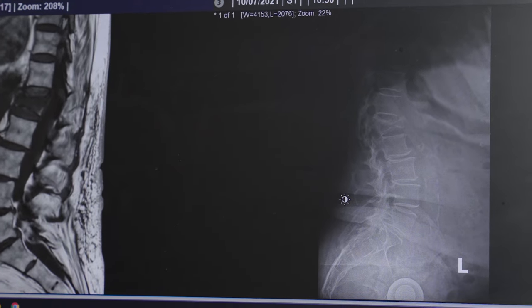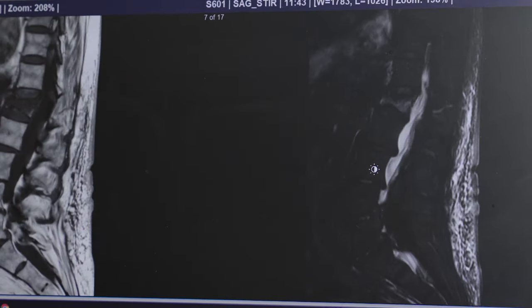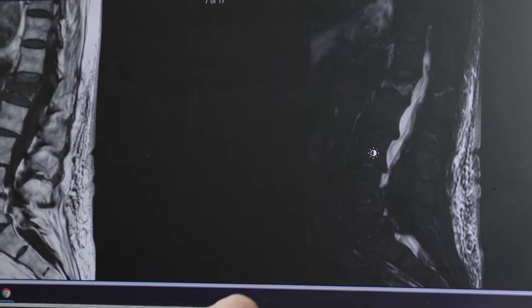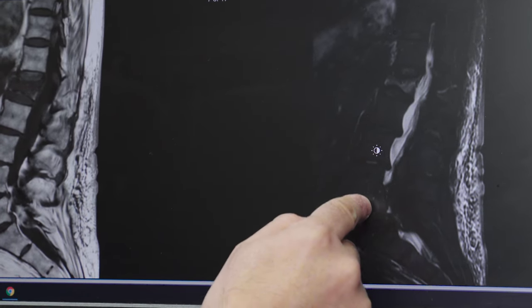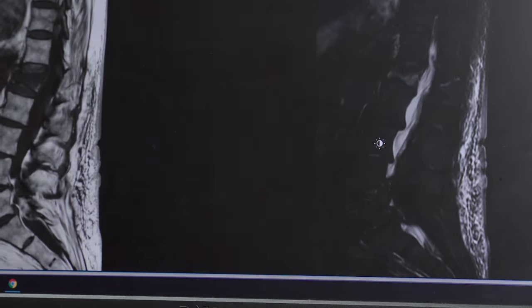We need to get an MRI, and the best thing to look at on your MRI is the STIR imaging that shows us edema and inflammation. We once again will come from the bottom: L5, L4, L3, L2, L1, and we have that L1 compression fracture there.